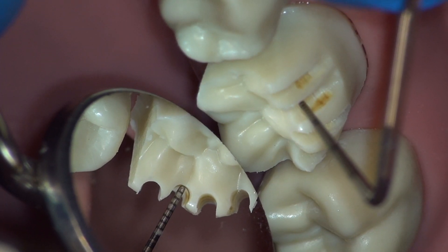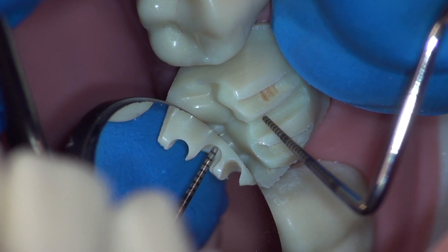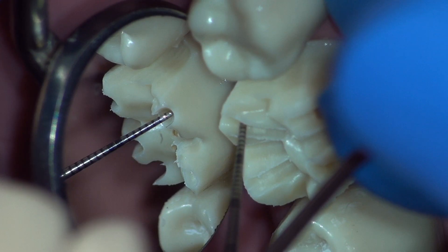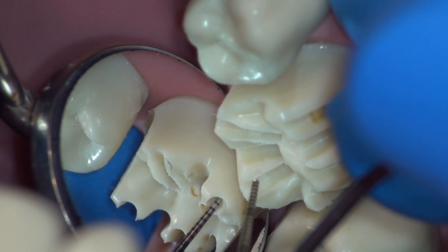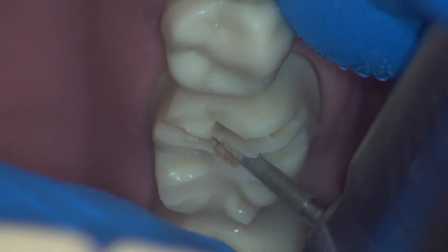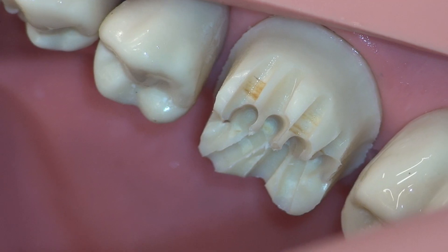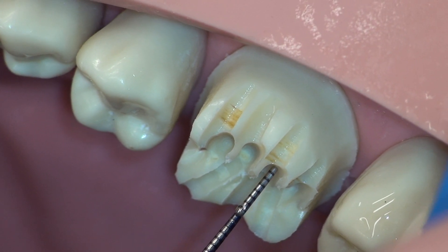Here's another look at our commonly under-reduced buccal groove. We must fix this before moving to the next step. Now we are at 1.5 millimeters. Proceed with 1 millimeter depth grooves on the lingual aspect, again at all cusp tips and occlusal grooves. Measure in a similar fashion and again watch out for the lingual groove. Proceed with the 1.5 millimeter functional cusp reduction. This reduction can be evaluated with a direct view rather than with a mirror. When measuring, visualize where the external surface of the tooth once was.